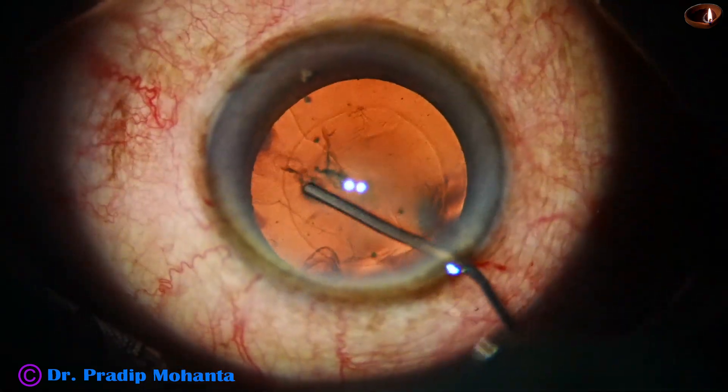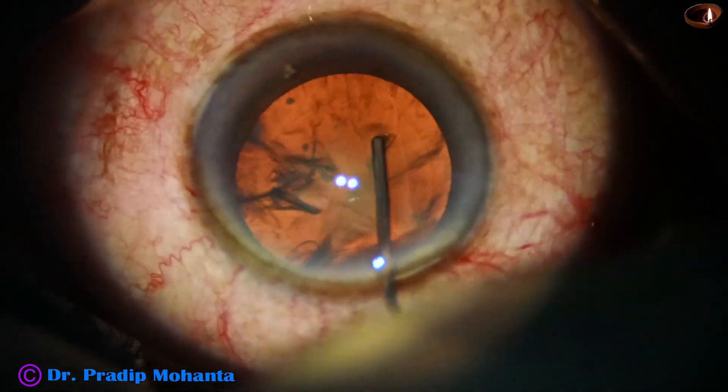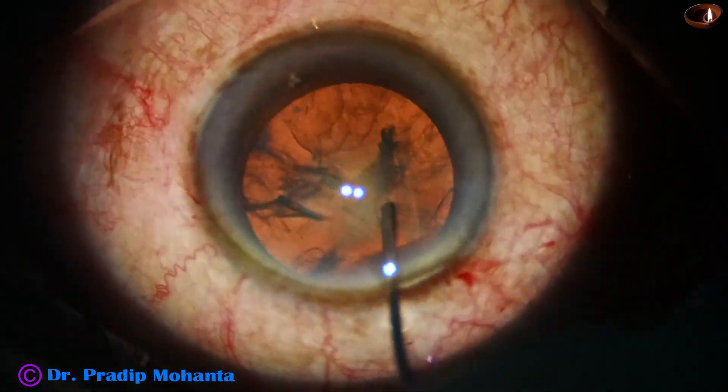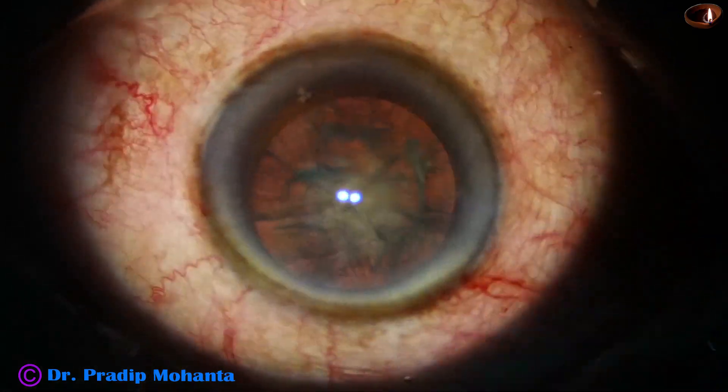Hydrodissection is done with the help of BSS and a 27-gauge cannula. The nucleus rotates beautifully.